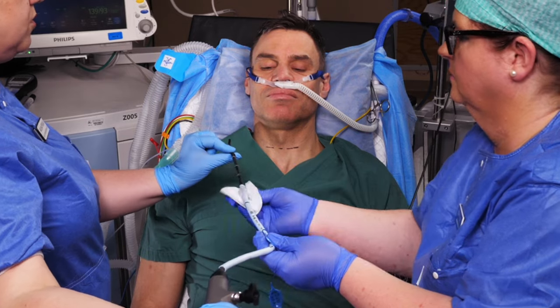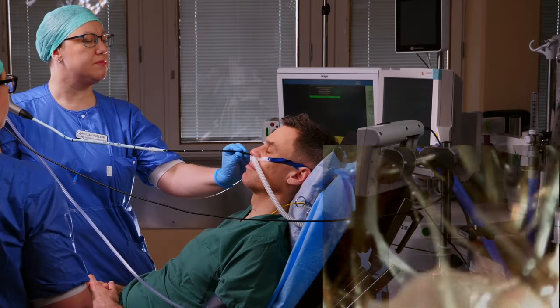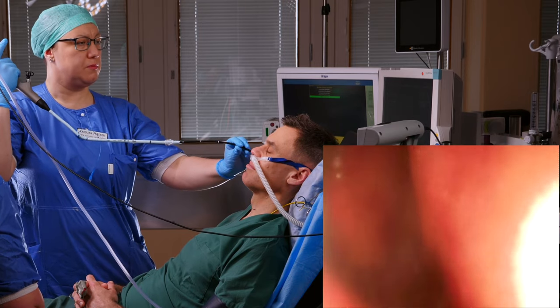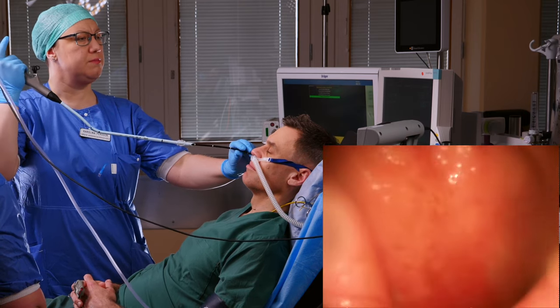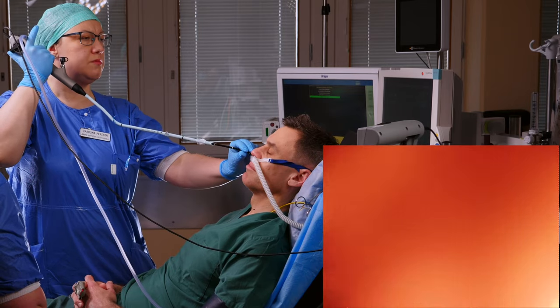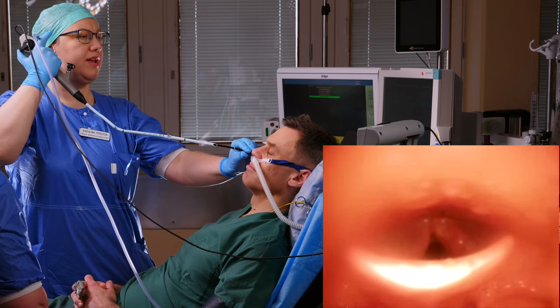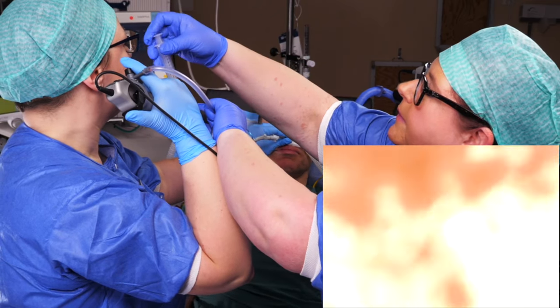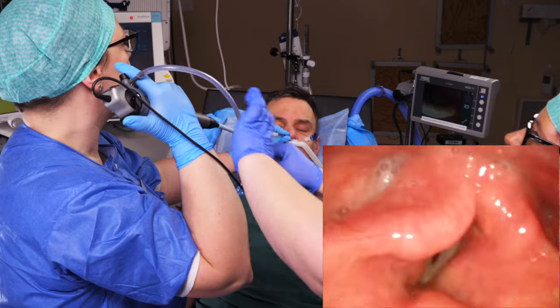You may need to remove the proximal connector, but make sure not to lose it. Introduce the bronchoscope into the nasal cavity and carefully make your way into the oropharynx, looking down at the base of the tongue. Keep communicating with the patient as you proceed. If the patient experiences discomfort, retract the scope, spray more local anaesthetic and be sure to await the onset. Proceed to identify the epiglottis and place the bronchoscope just above the vocal cords and spray them with local anaesthetic. The air in the syringe will aerosolize it. Repeat if necessary.